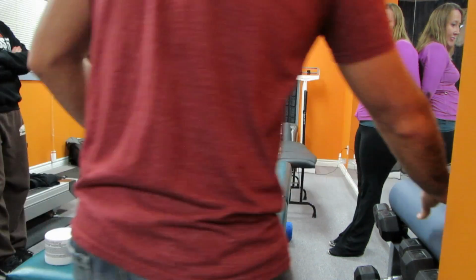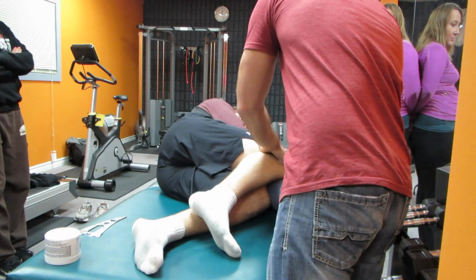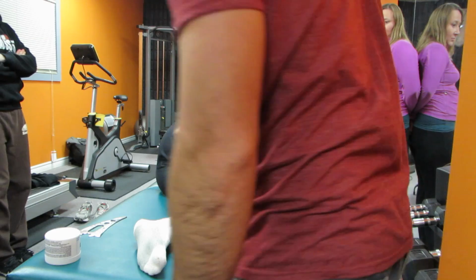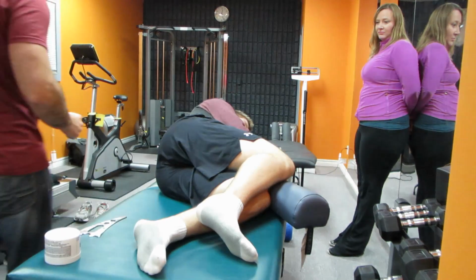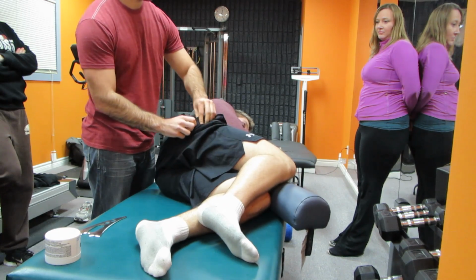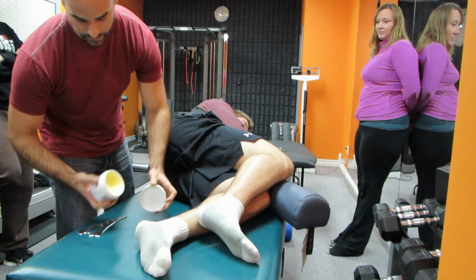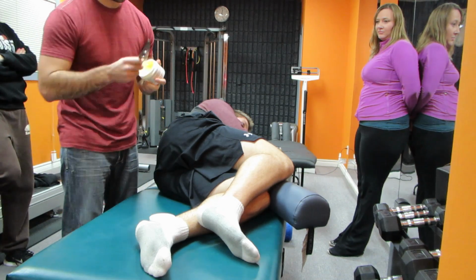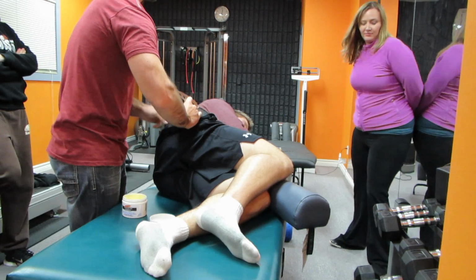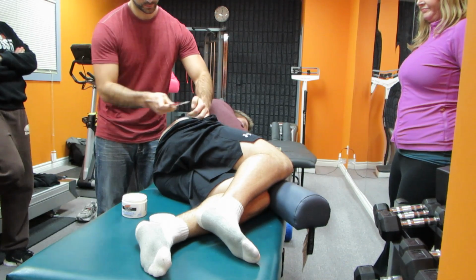So how we treat the glute is we'll get him to bring this up a little, just like that. So we have that slightly flexed, so there's a little bit of tension in the tissues there. We're going to pull your shorts down a little bit, okay? What we'll do is first we'll attack the glute med, the glute min, and that stuff.